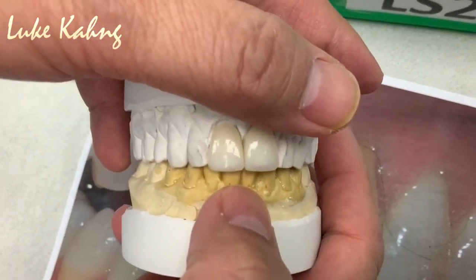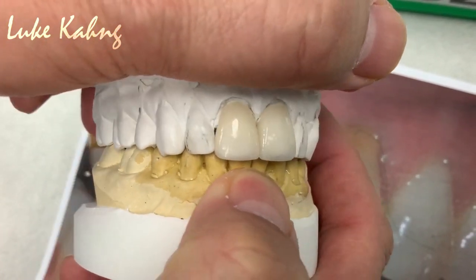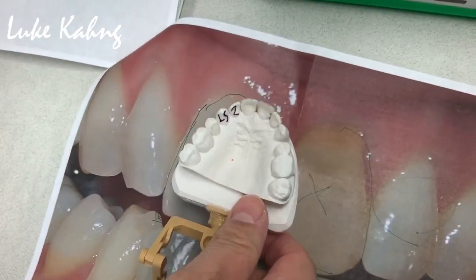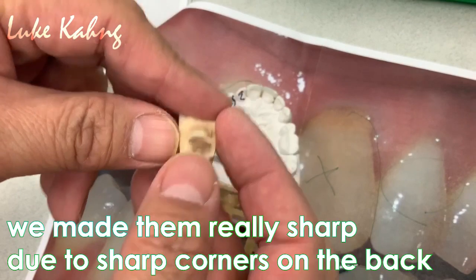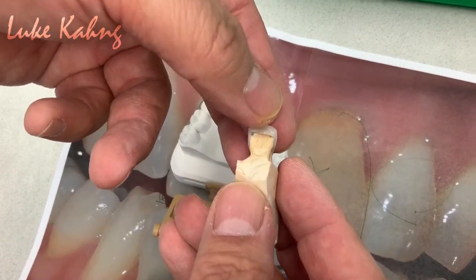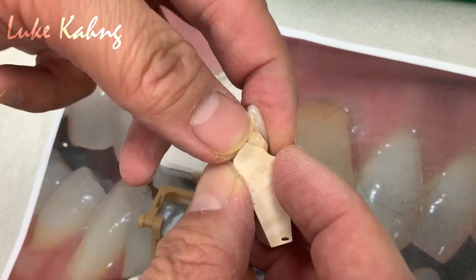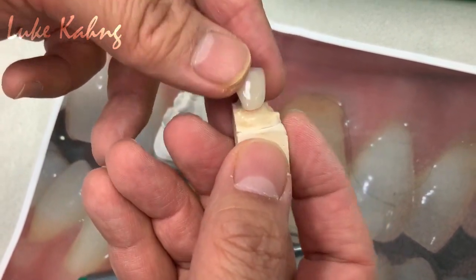This is the final restorations with a symmetry. Okay, due to sharp corners, the back side, so we made it really sharp. So we had a spare die, just to make sure the wall is fitting. Just like that. It's really tough to match the margin.